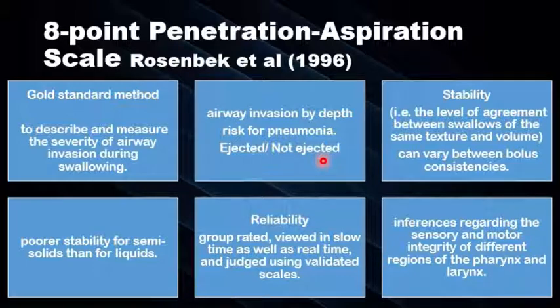The method should be fairly reliable and stable, and there are ways to improve the reliability and the stability of the scoring system, including group rating rather than individual rating of the degree of invasion and the severity of aspiration, and reviewing the videos in slow motion as well as real-time speed, and judging the degree of the invasion by the validated scales.